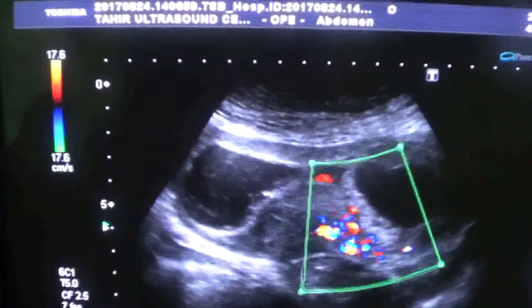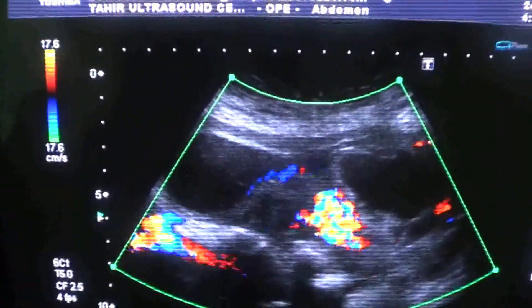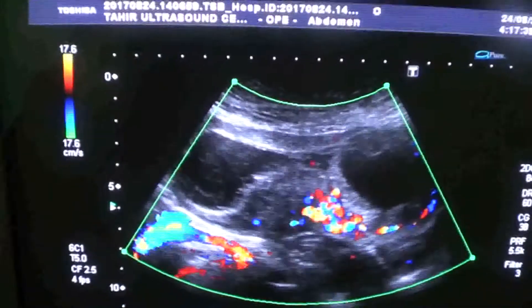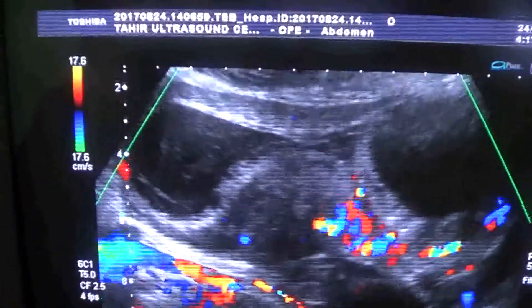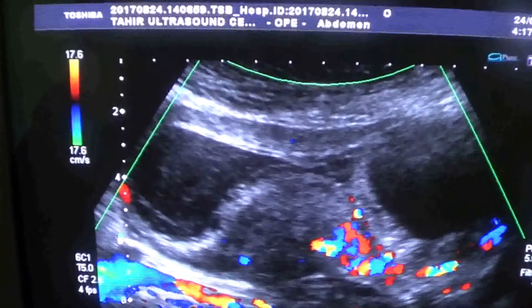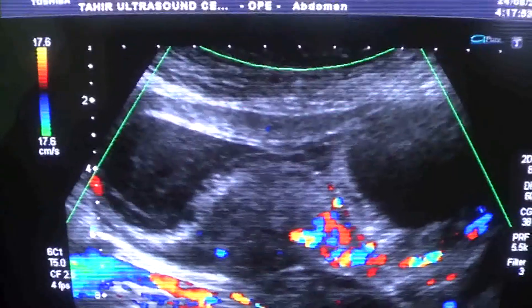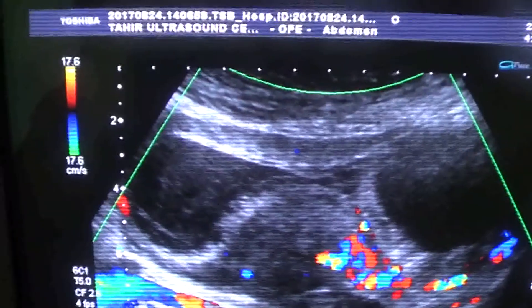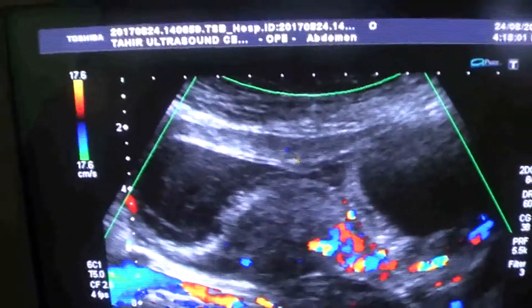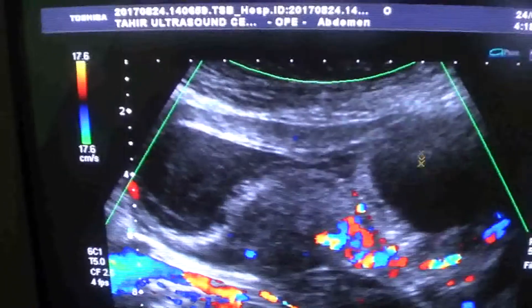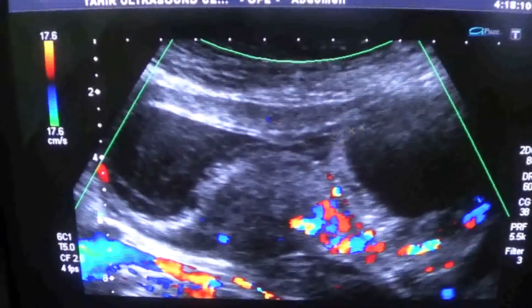So this is a case of an early twin pregnancy with two gestational sacs, no fetal poles seen in either, and both measuring more than 25 millimeters. This is a blighted twin pregnancy — both sacs are anembryonic. The two sacs are clearly seen separated from each other.